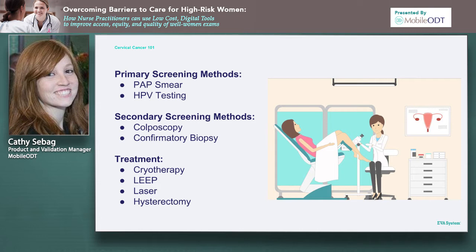Often a special diluted acid called acetic acid is applied to the cervix, and any suspicious lesions are usually white and pop out pretty clearly. Now, today I'm not going to go into the clinical side of colposcopy, but you are able to go to our website and see a webinar by Dr. Mary Rubin, who does explain some more of the clinical indications. If there are suspicious areas to be found in the United States today, most often women will undergo confirmatory biopsy to tell the type and the grade of lesion that's then used to make a treatment option.